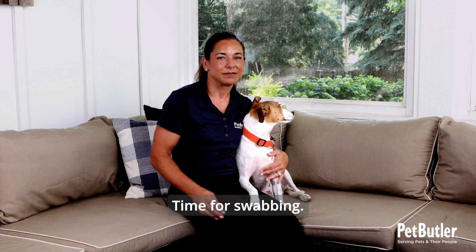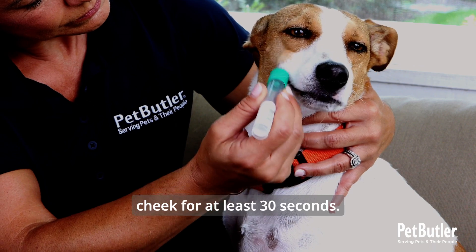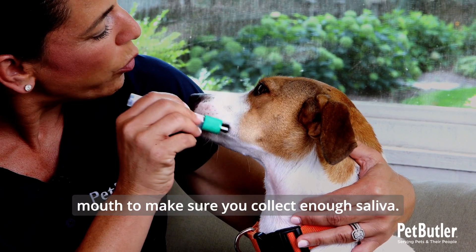Time for swabbing. Take the swab and gently run it on the inside of your dog's cheek for at least 30 seconds. Remember, the goal is to ensure that it's covered with saliva. You may need to swab both sides of the mouth to make sure you collect enough saliva.